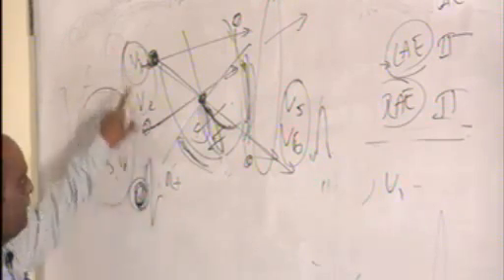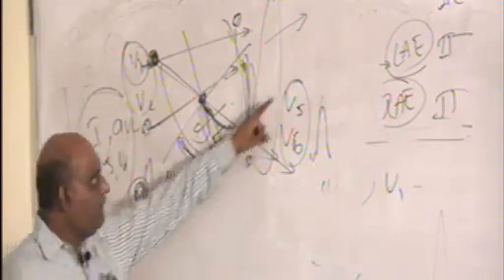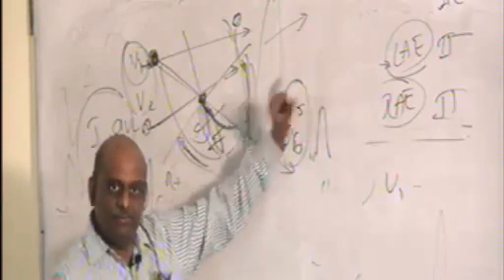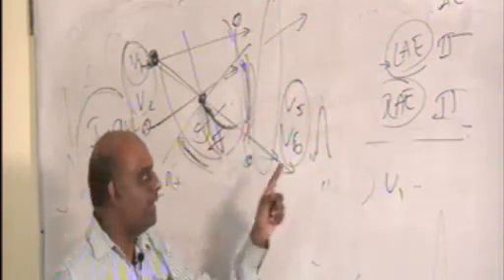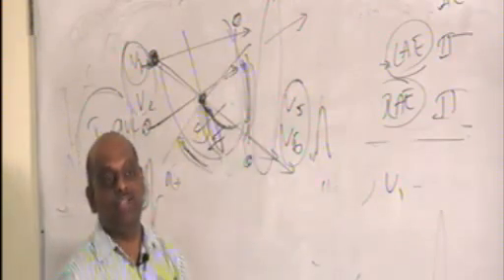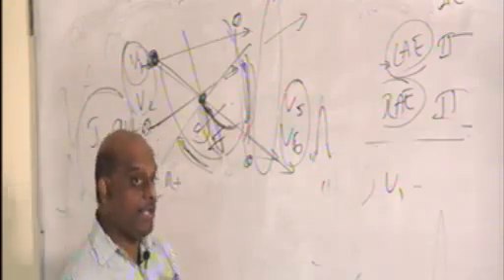Finding Q before R in V1, V2 is abnormal. Finding Q before R in V5, V6, AVL and lead 1 is normal. Right? So Q wave in V5, V6 and lead 1 and AVL is called physiological Q wave. When do you call pathological Q wave?